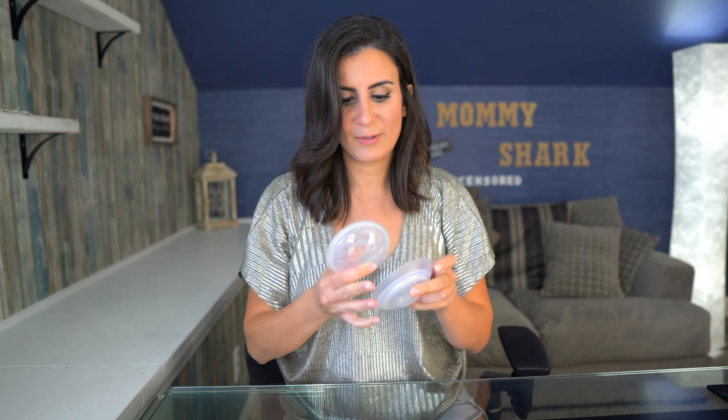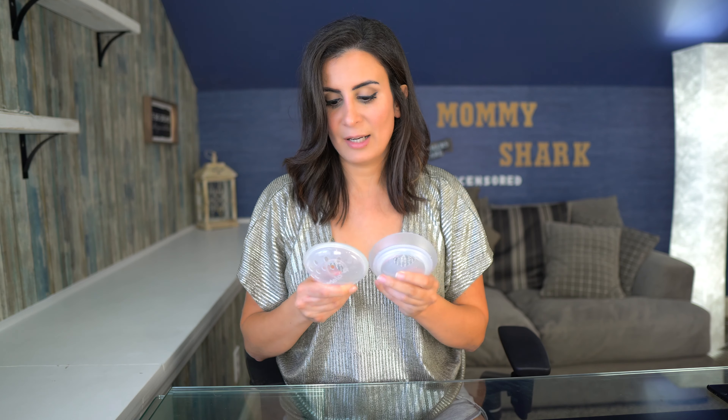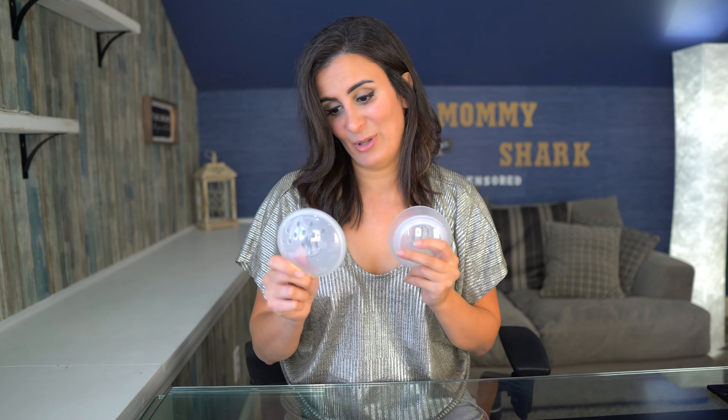For purpose number two — injured nipples — definitely go with the Medela Soft Shells. For purpose number three — soreness — the Medela Soft Shells were not very nice on the nipples. Even though these are made for soreness, I don't recommend them because it actually hurt. I would definitely give it to the Elvie Catch for soreness. If you have soreness and want to make sure nothing's rubbing against you, the Elvie Catch wins because the hole is bigger, it's a lot softer, and it does not have that hard circular ridge. Definitely go with the Elvie Catch for soreness.